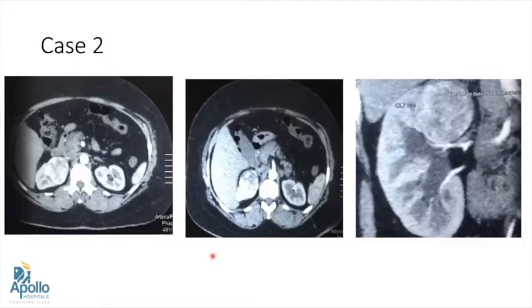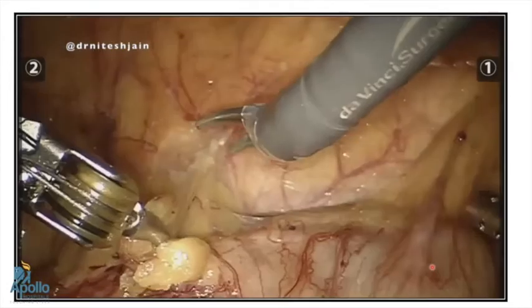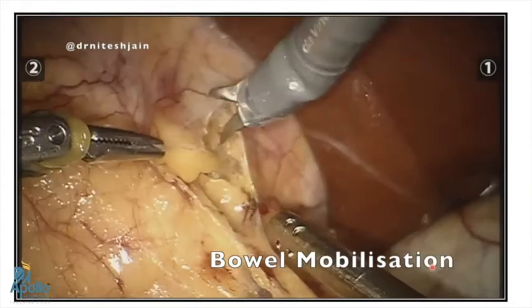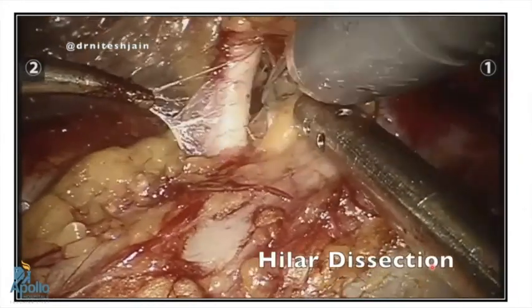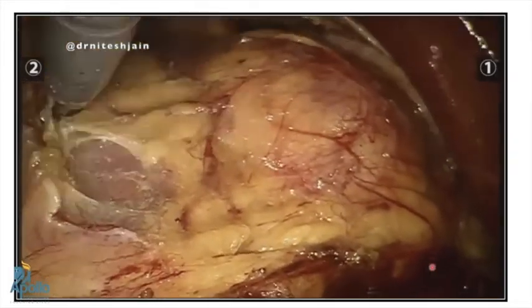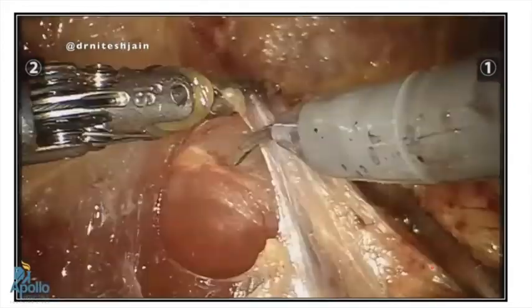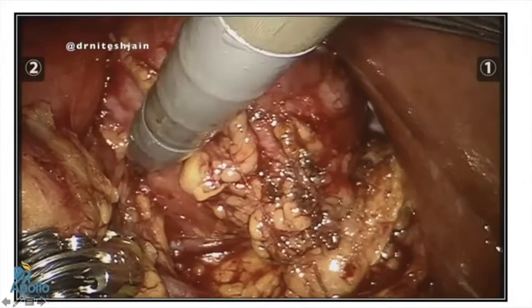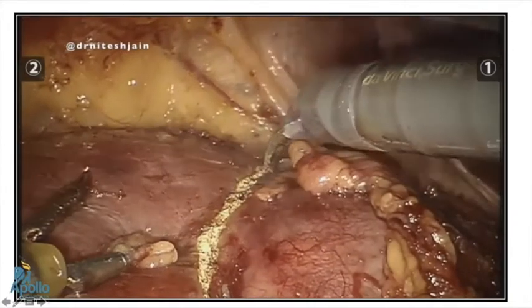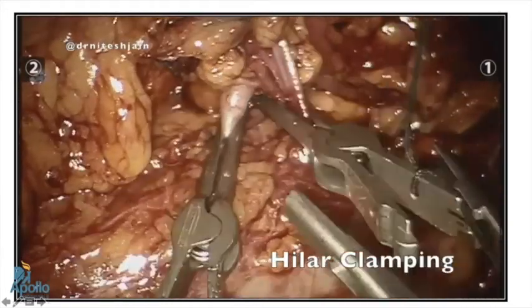The next case is a large 4.4 cm upper pole tumor lying close to the hilar vessels. Surgery begins with mobilization of the colon, which is mobilized adequately all around. The peritoneum over the kidney is cut using sharp and blunt dissection, and the hilar vessels are individually dissected. Since this is a very endophytic tumor, a drop-in ultrasound is really useful. We can see the tumor entering the hilum, so the kidney must be completely mobilized.